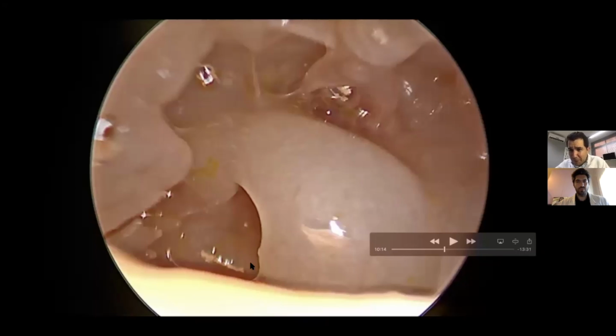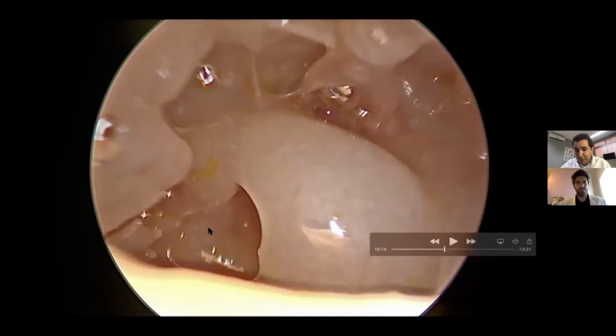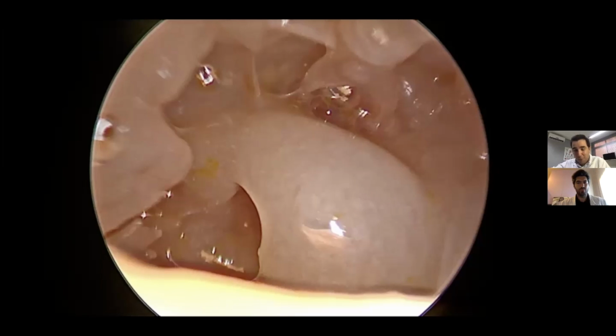And why is sinus subtympanicum important? Because you have two very important structures inside it. One of them is this one here, which is kind of a finger pointing out the region of the round window niche, and it's also the floor of the scala tympani. So if you are doing cochlear implantation, and you can't find the round window niche, or you want to be sure you put your electrode in the scala tympani, you look for the fustis. This is the fustis, the floor of the scala tympani. If you follow the fustis, you're going to be at the scala tympani.